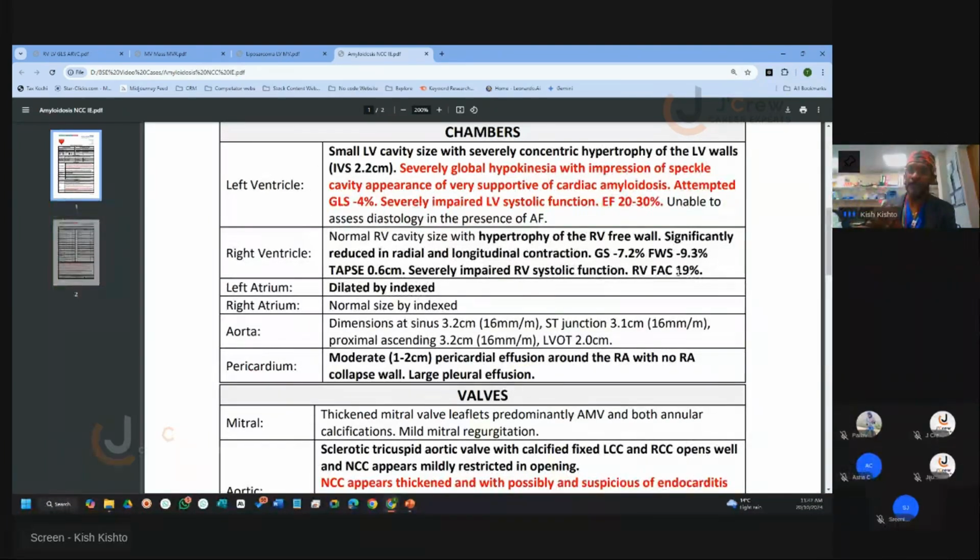of all these measurements. In many countries people scan and report, but here they rely a lot on our clinical report if you are accredited to a very high standard in terms of BSE, because you're making these diagnoses and they will base your treatment on what you wrote there. Mainly the non-cardiology teams, though some cardiology doctors here will review the images for themselves. But at the end of the day, if it is a non-cardiology team, they will rely a lot on the report you've written to base treatment.